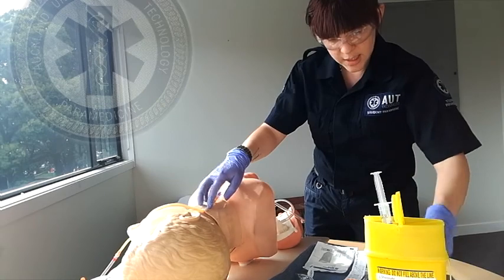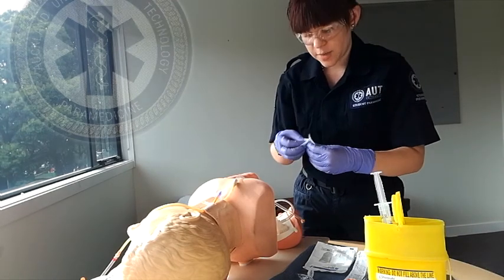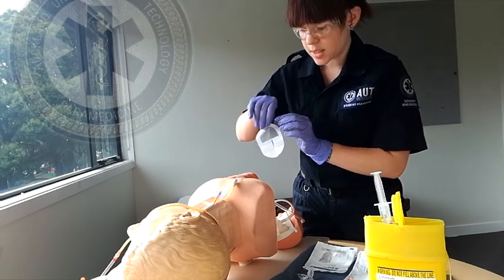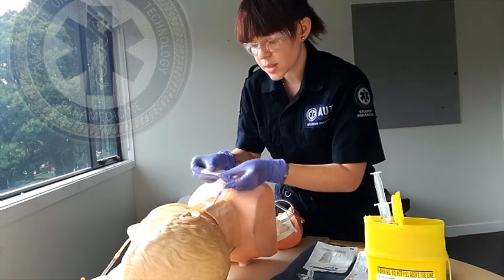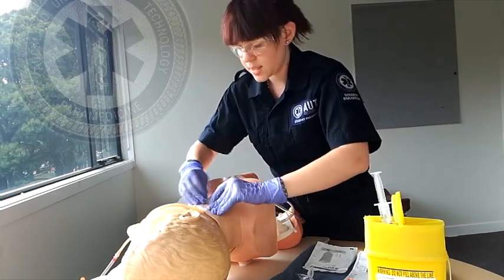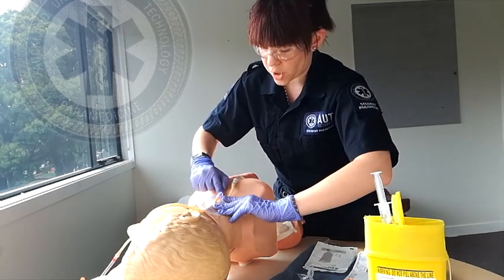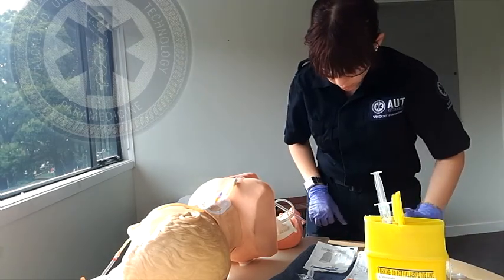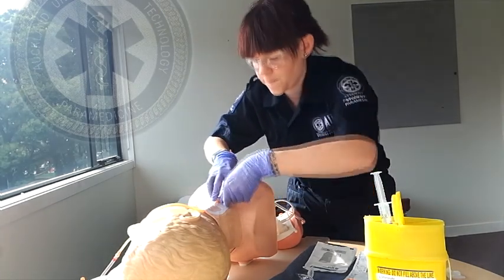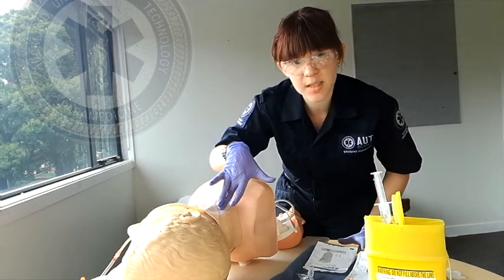I'm now going to secure the IV line with my Tegaderm. This is not a standard Tegaderm but it can be used. I'm just going to attach this, trying to get it as neat as possible so you don't annoy the nurses at the hospital. I'm going to secure this again with a little bit more tape, as there's a high risk of movement to the cannula in this area. I would document the date, time, and gauge size onto the Tegaderm itself for hospital use.